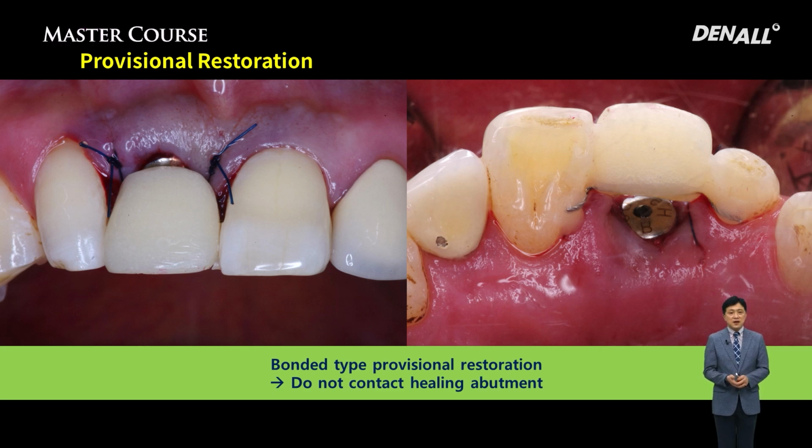There are about 3 ways. In this case, the bonded type is used. Palatally, a wire is added for the bonded type.